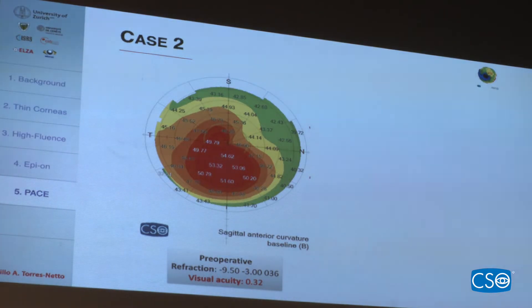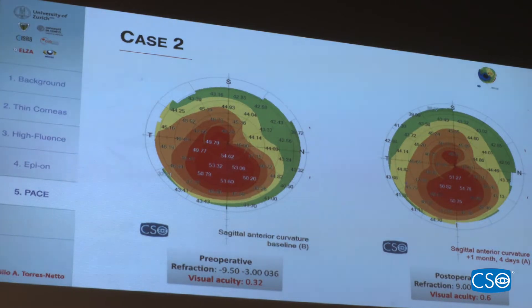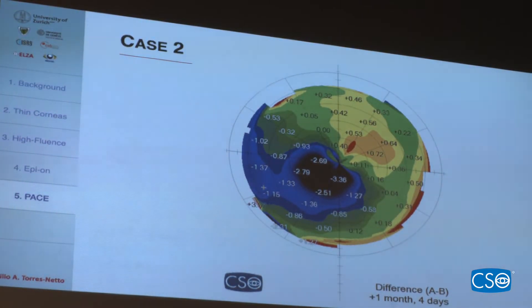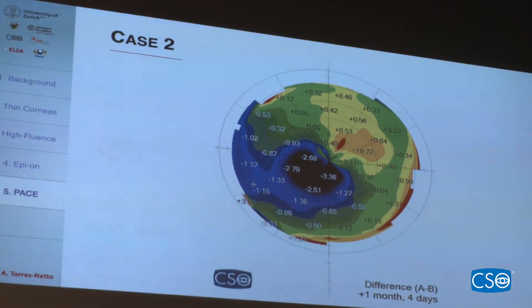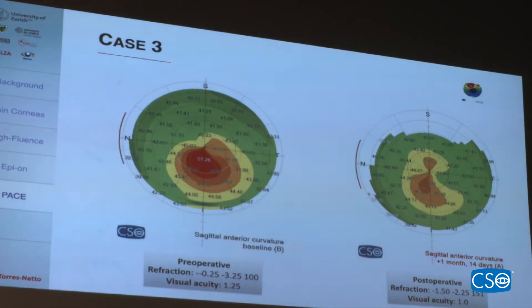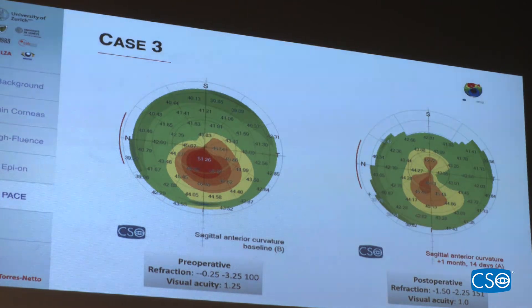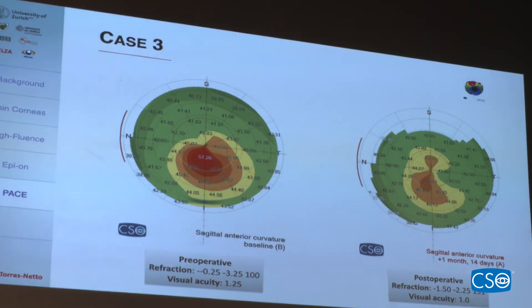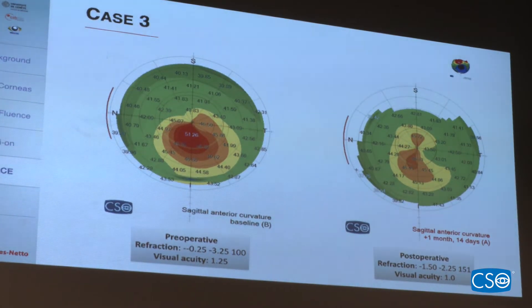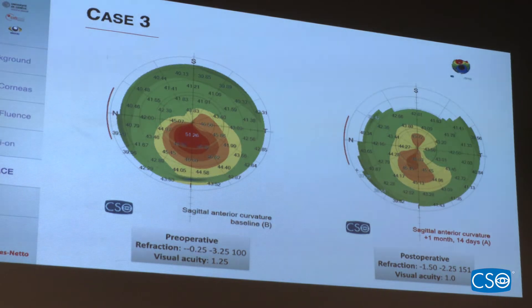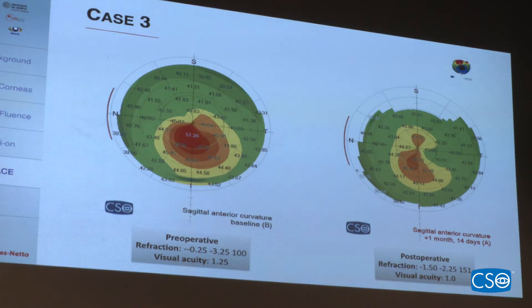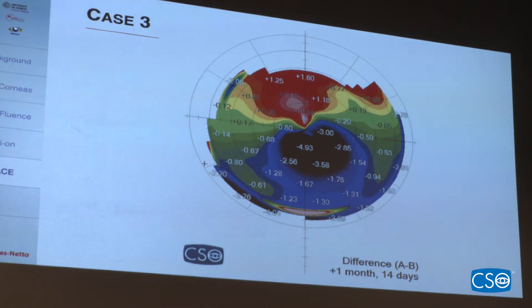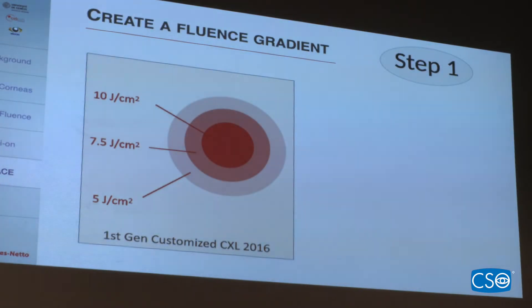Another example: 53 diopters, visual acuity of 0.3. After only one month we saw around 3–4 diopters of regularization. A recent case I saw a few weeks ago showed no tissue removal — only cross-linking — and the differential map showed almost 7 diopters of regularization, making the cornea much more regular. No excimer laser was used.